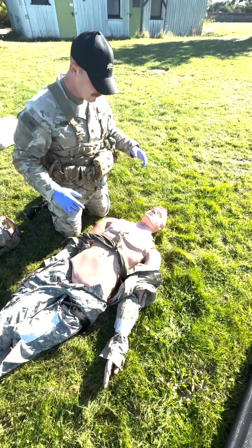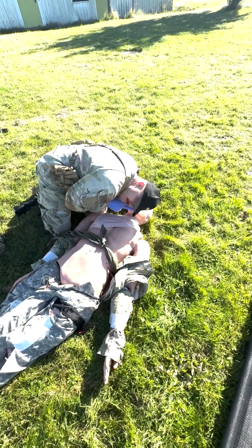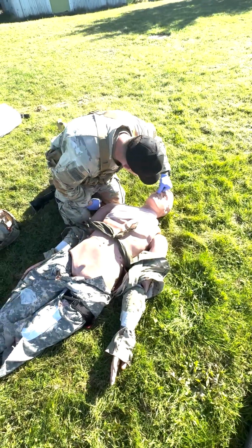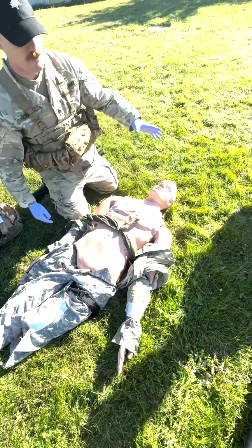I have my BSI. I'm going to go ahead, assess the airway. Go down using the head tilt chin lift. Look, listen, and feel. Go ahead, put the head in the supine position. I'm going to go ahead and check for nasal obstructions. Nasal passages are obstructed. I'm going to go ahead and check airway for patency. Airway is not patent. I have to do a cric on this guy.